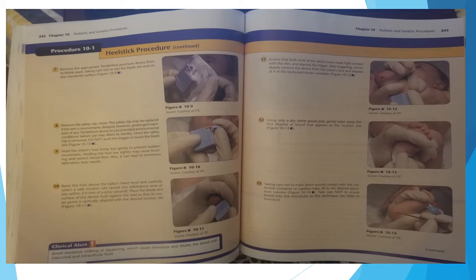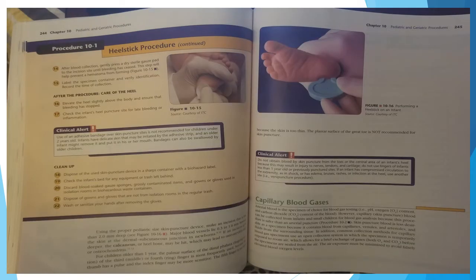Using only a dry sterile gauze pad, gently wipe away the first drop of blood that appears at the incision site. Taking care not to make direct wound contact with the collection container, fill the capillary tube to the desired specimen volume. Take care not to scoop blood into the microtube, as this technique can lead to hemolysis. After blood collection, gently press a dry sterile gauze pad to the incision site until the bleeding has ceased. This step will help prevent a hematoma forming.